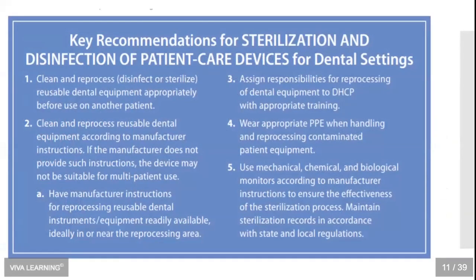Now, in the CDC summary, there are little blue boxes periodically that provide key recommendations in certain areas of infection prevention. This, of course, is the key recommendations for sterilization and disinfection of patient care items for dental settings. And I'd like to spend a couple minutes and go through these with you and to know what the CDC says.